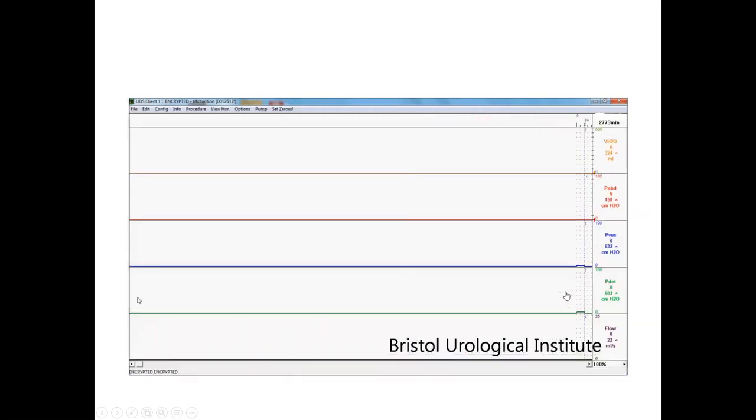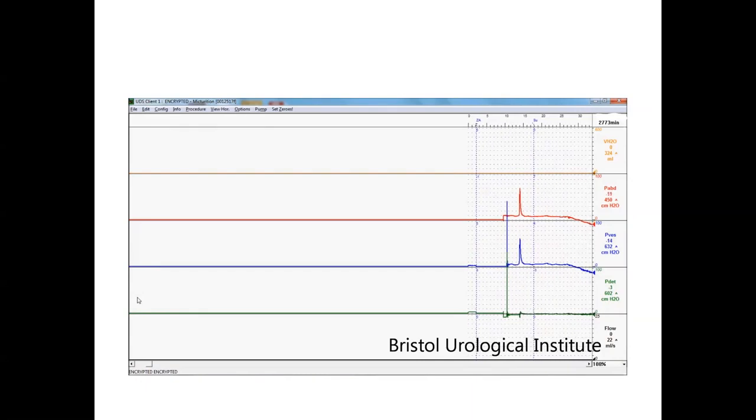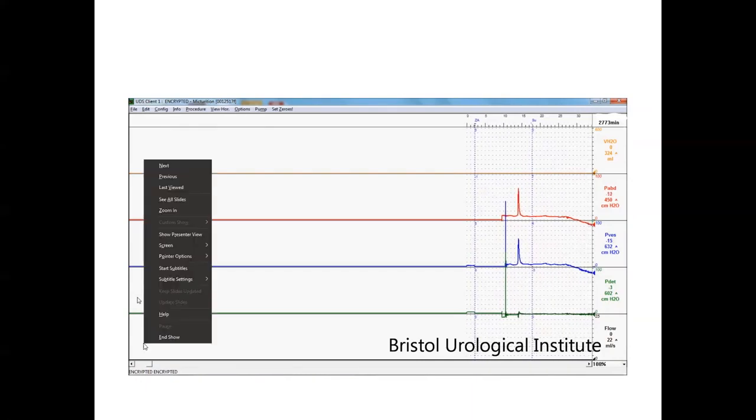Okay. We've got one final one before I hand over to Marcus. So let's just have a little look at this one. Okay, so it's on, it's recorded from our patient. It was a good cough test. And then what's happening? Okay, so this is what starts to happen during your test. What's the first thought? It's the first thing that anyone would be concerned about. It's on both lines, and it's a change in your resting pressure below zero.